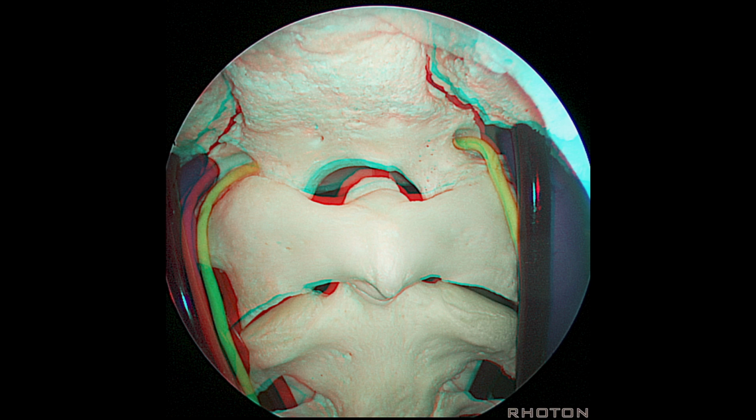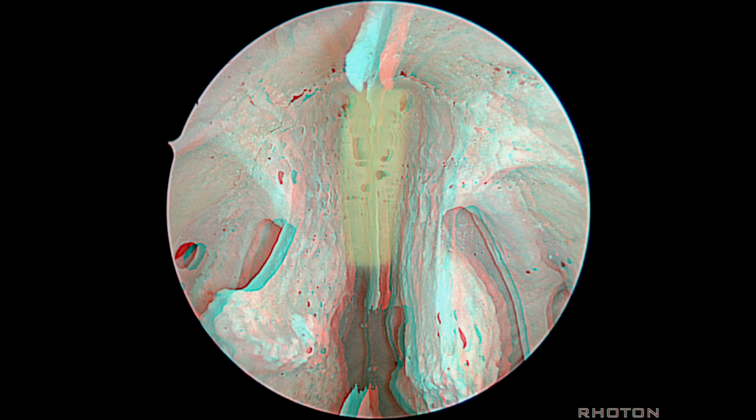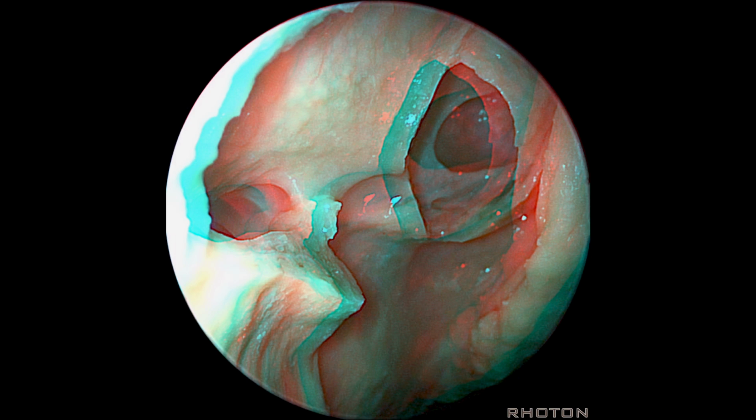You have access to the lower clivus, and just a view up the nose at the cribriform plate. And this really is a very narrow area, so that to get it exposed, you have to open over it through the ethmoids and work your way back. So here we made an opening in the ethmoid air cells on the right side, the opening into the maxillary sinus, inferior turbinate. The middle turbinate is pulled medially. So this is all middle meatus.